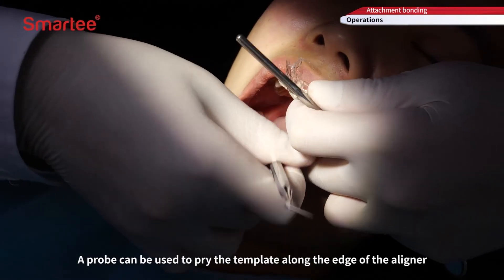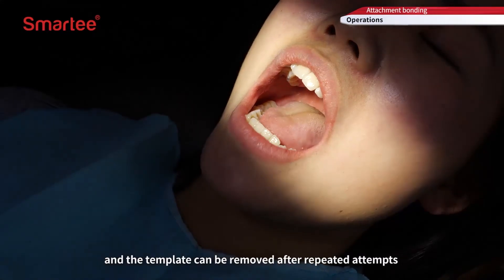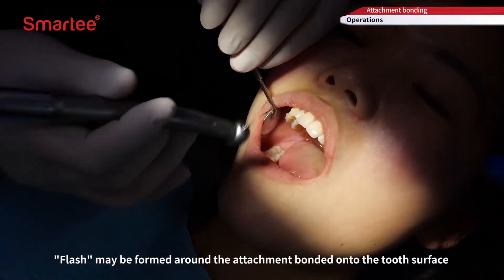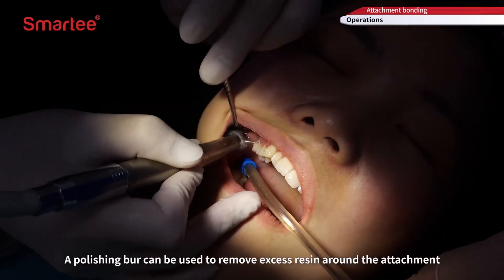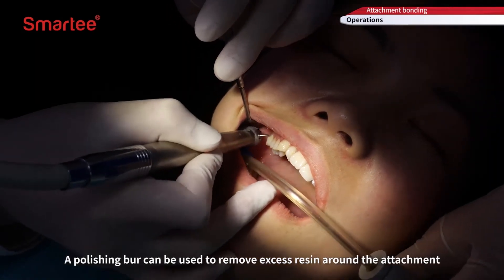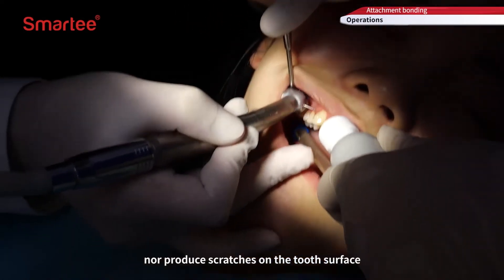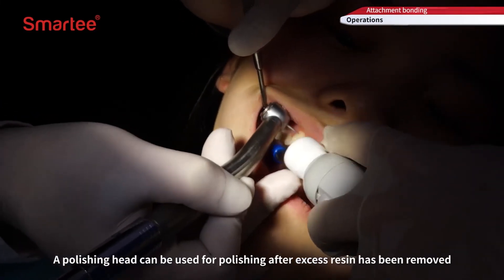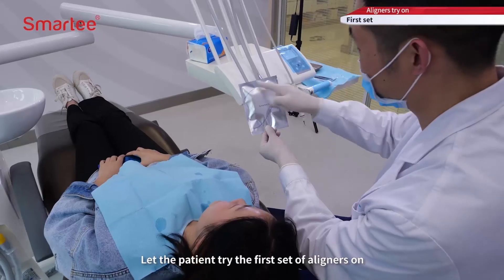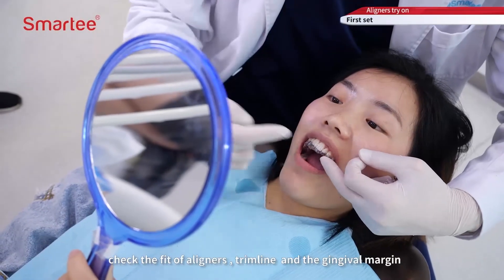A probe can be used to pry the template along the edge of the aligner, and the template can be removed after repeated attempts. Flash may be formed around the attachment bonded onto the tooth surface; a polishing bur can be used to remove excess resin around the attachment. Do not damage the four sides of the attachment or produce scratches on the tooth surface. A polishing head can be used for polishing after excess resin has been removed. Let the patient try the first set of aligners on and check the fit of aligners, trim line, and the gingival margin.